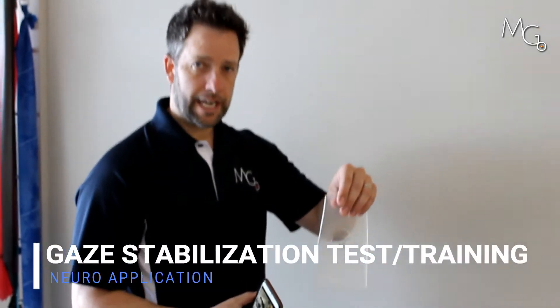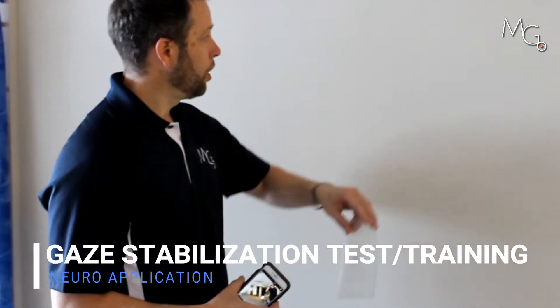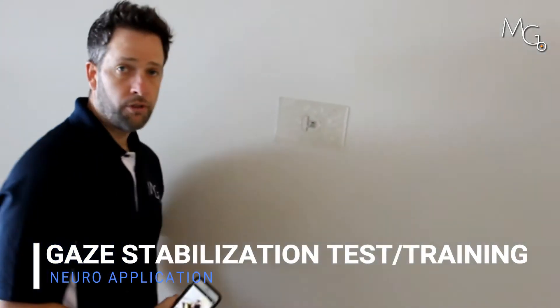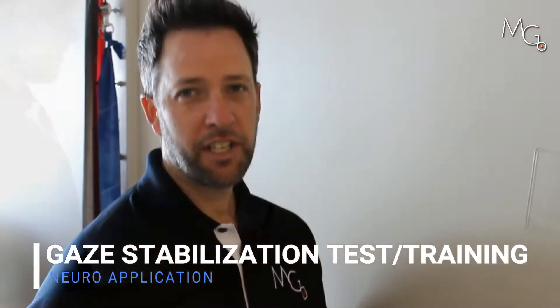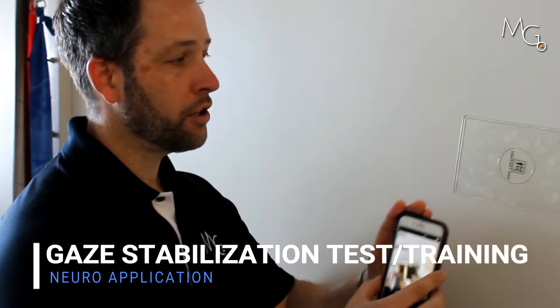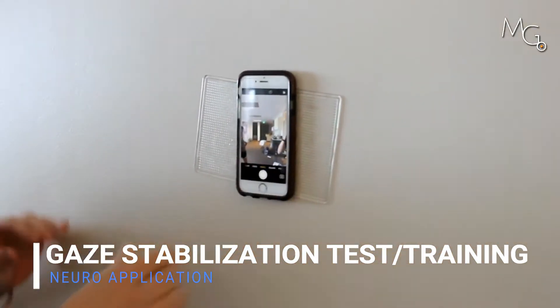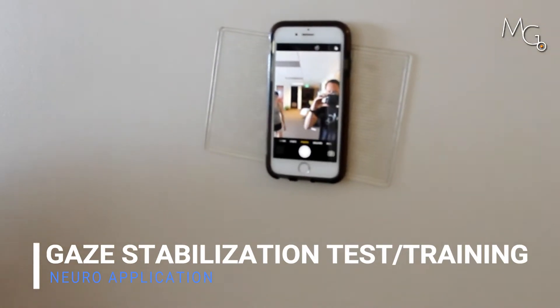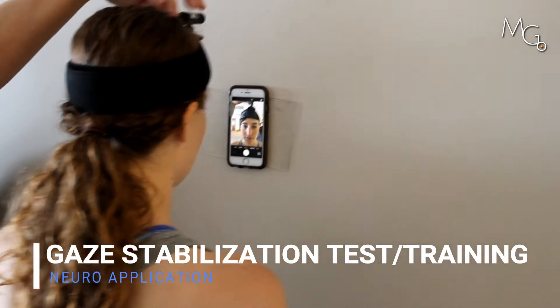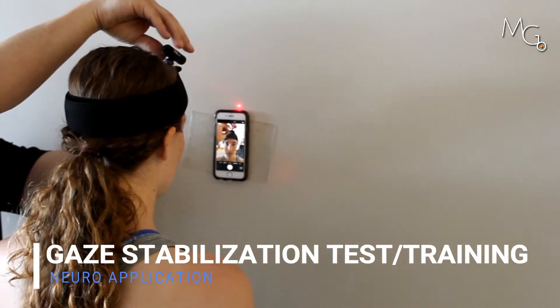Another use of the motion guidance contact pads for eye movement and head control applications would be to take your contact pad and put it on the wall — nice and sticky surface. We can take your smartphone, turn on the camera and flip it so you're looking at yourself. Put this on the wall, have the patient stand close to the phone, and take the laser and adjust it right over the top of the phone.